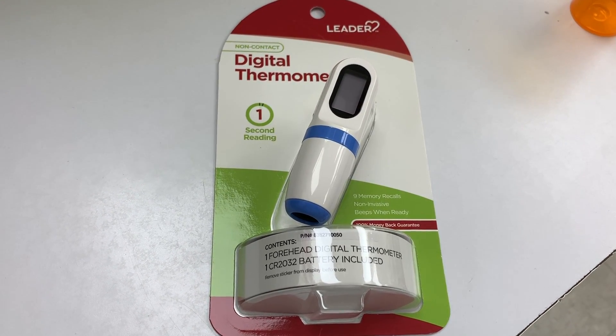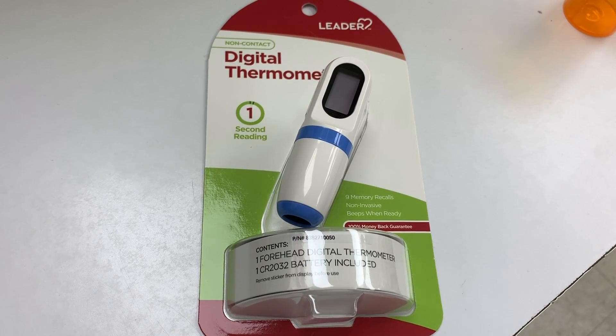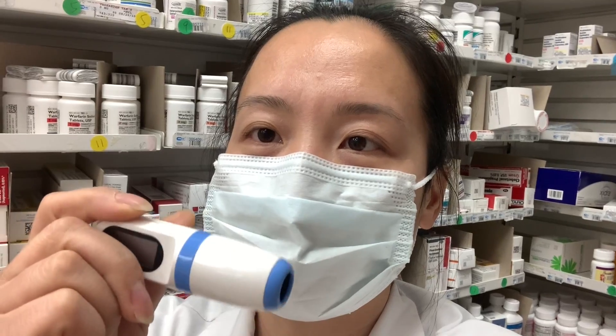This is a digital forehead thermometer. It is really easy to use and uses the round CR2032 battery. This is how small it is.